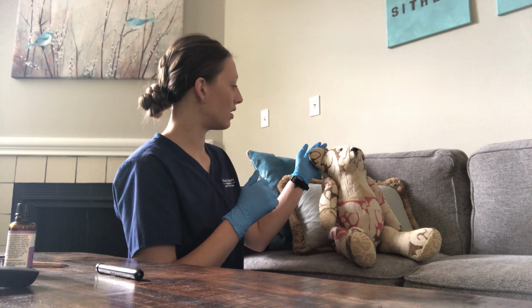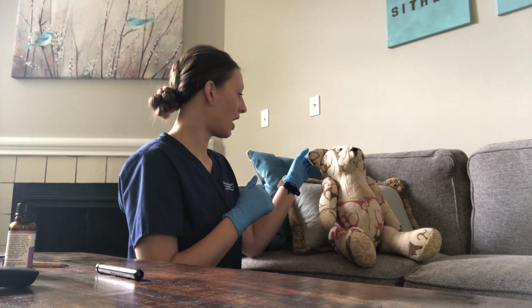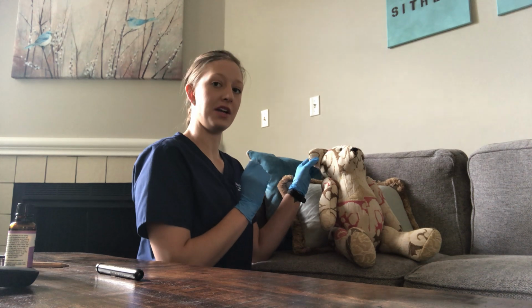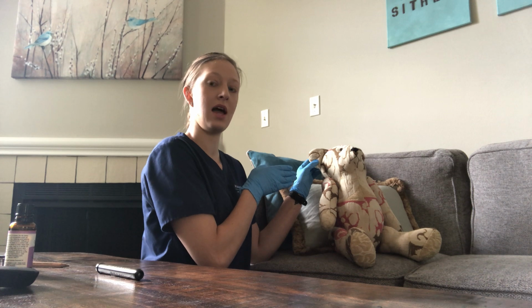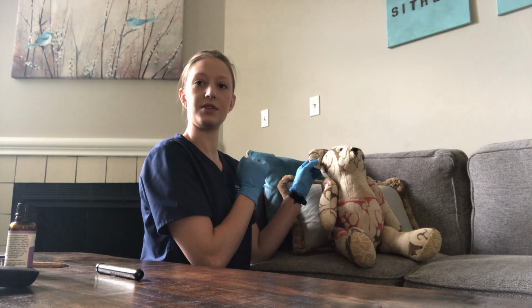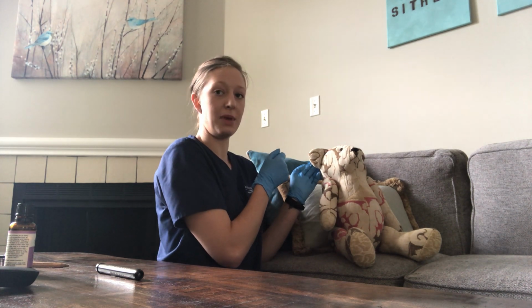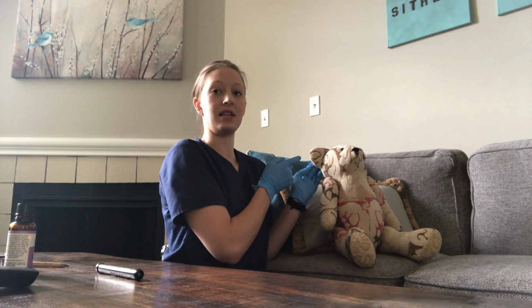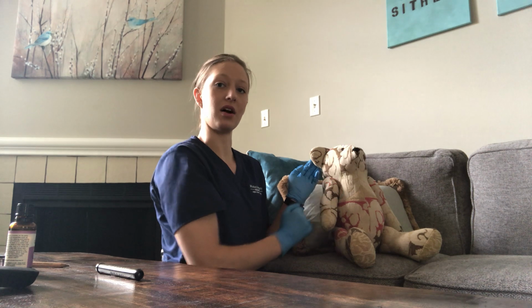They are proportionate to the head. I would also need an otoscope to do this, but I do not have one. But by using the otoscope, I'm going to check the ear canal and make sure that there's no excessive cerumen, and that there are no lesions or anything like that. I would shine the cone of light to assess the tympanic membrane, which should be a pearly gray color. And the cone of light should reflect at, this is the right side, it should reflect at 5 o'clock, and on the left side it should reflect at 7 o'clock.